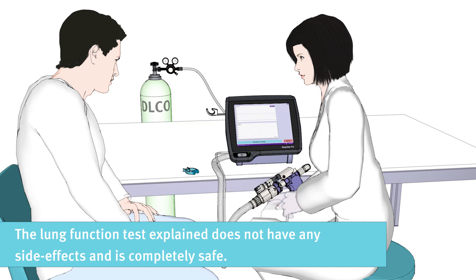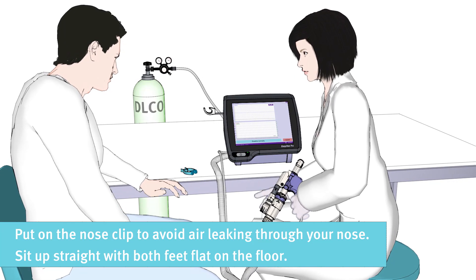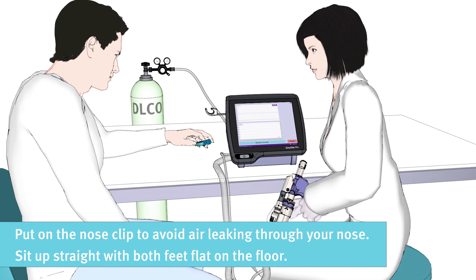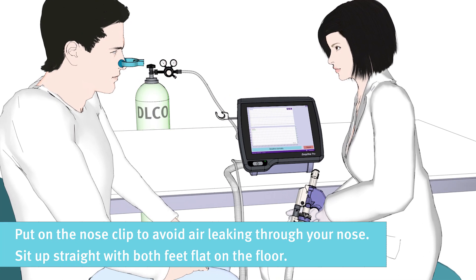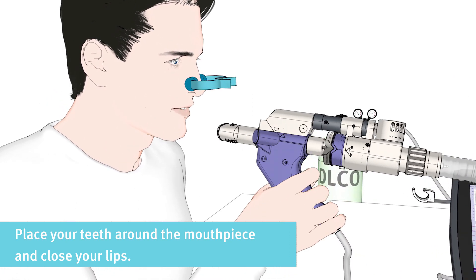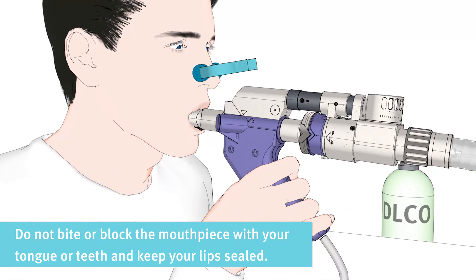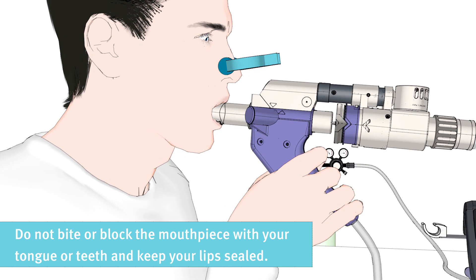The lung function test does not have any side effects and is completely safe. The nose clip is important to make sure no air leaks through your nose while performing the test. Please sit up straight with both feet flat on the floor. Please place your teeth around the mouthpiece and close your lips. Do not bite or block the mouthpiece with your tongue or teeth and keep your lips sealed.